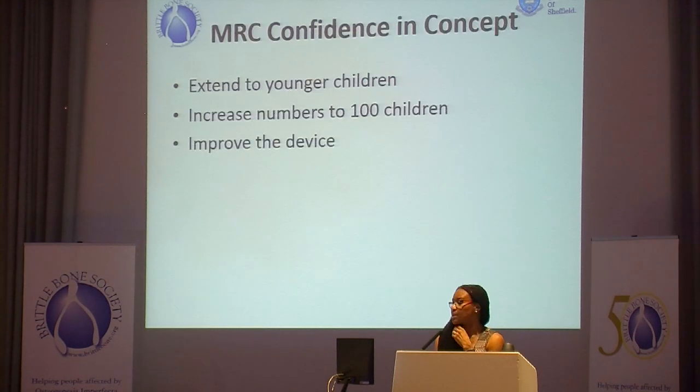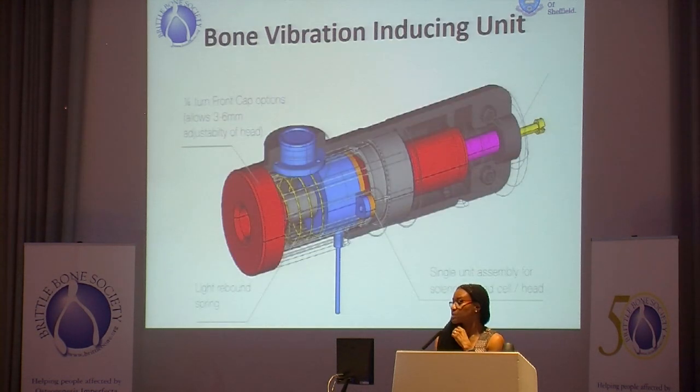which was encouraging, and got a further funding to extend this to younger children, so down to the age of 7, to try and recruit up to 100 children and to improve the look of the device, which was always a bit, for the younger children, it looked more frightening. And this is what we've got at the moment.